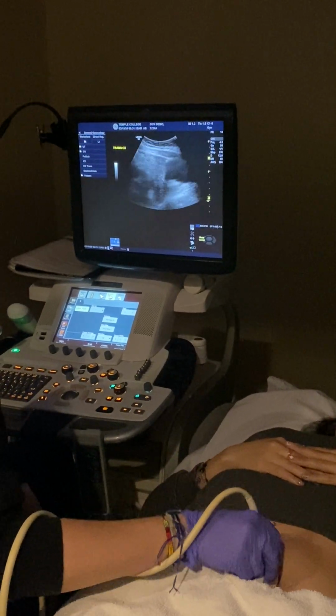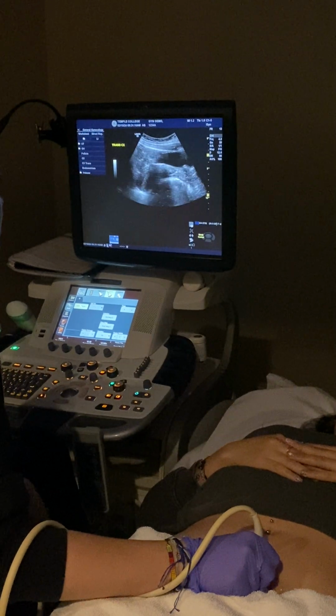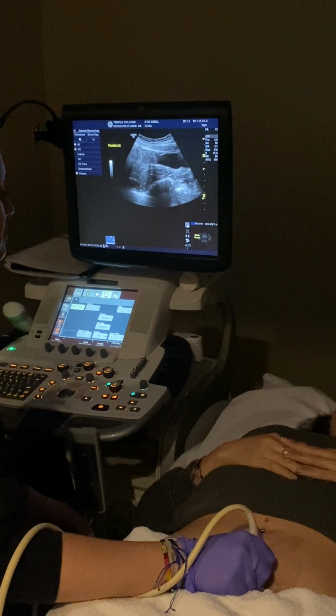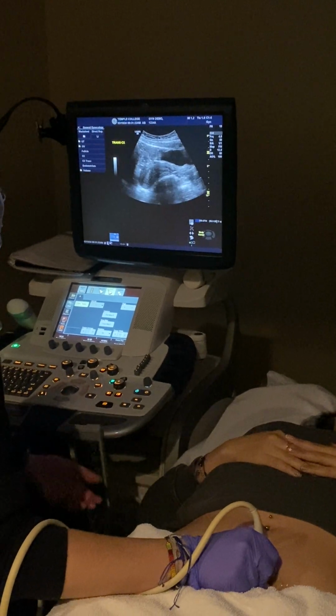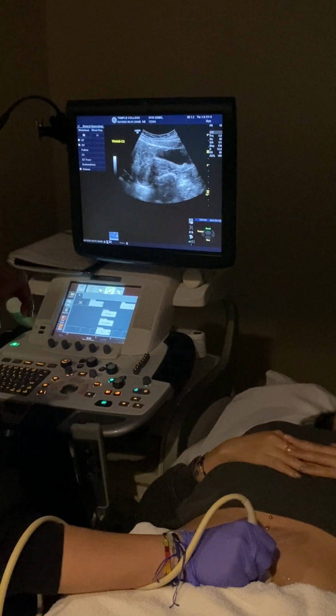Not really, right? A little bit of pressure, and now what do I see? I see what I need to see, right? Does that hurt? Uncomfortable? Okay. Don't be afraid to push, you guys. You're gonna have to. See, as the bowel gas moves, how much nicer it starts to look?